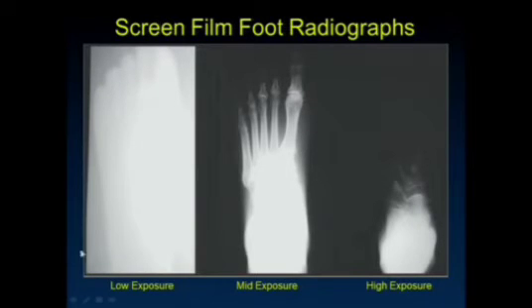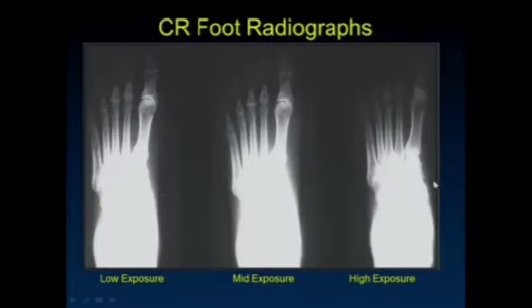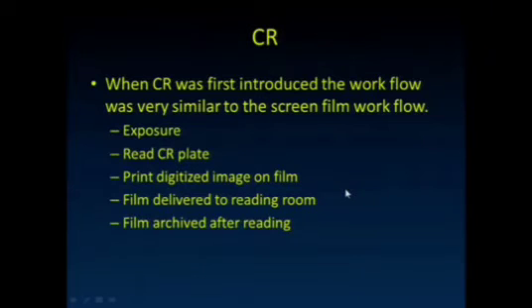So here are screen film foot radiographs, right? Low exposure, mid exposure, high exposure. And one of the big benefits of CR is, like we said, that more uniform response, really, that linear response across a wide range of exposures.